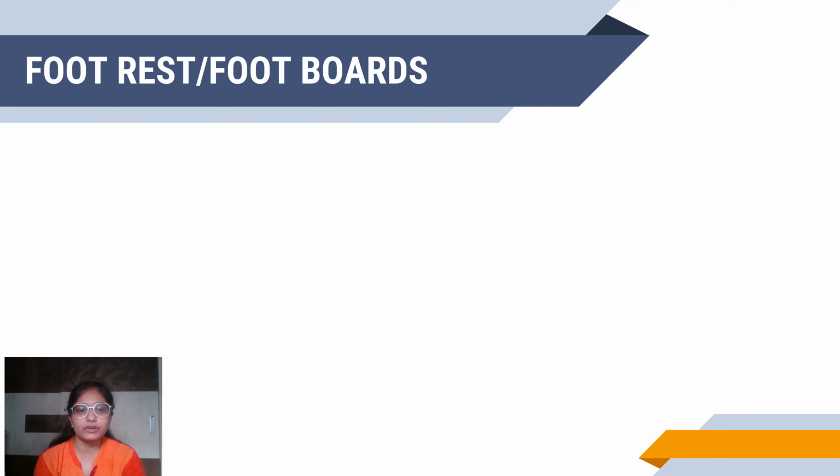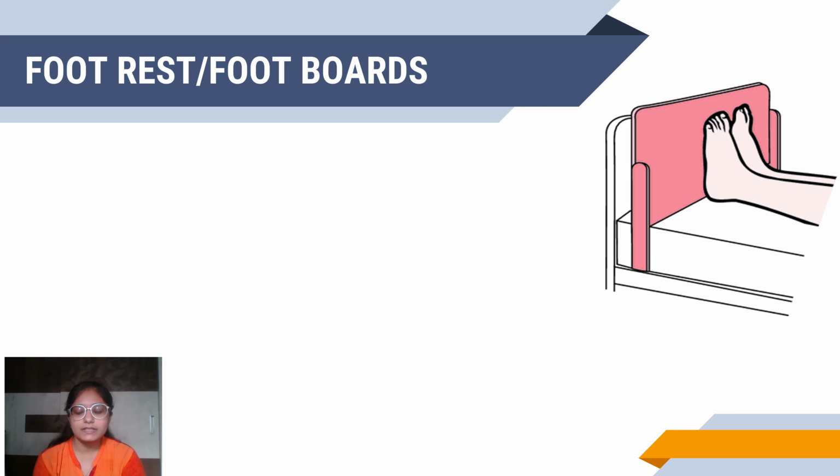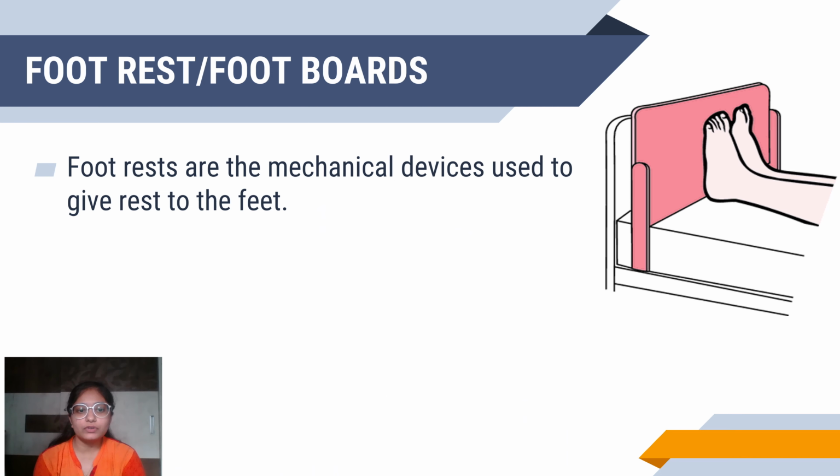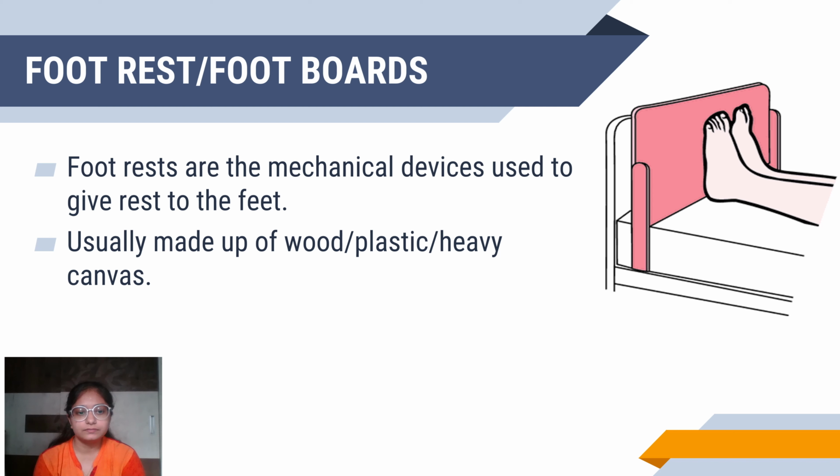Next is foot rest. Another name is foot boards. This is a picture of a foot board. The foot rests are mechanical devices which are used to give rest to the feet. The footboards or foot rests are usually made up of wood, plastic or heavy canvas.